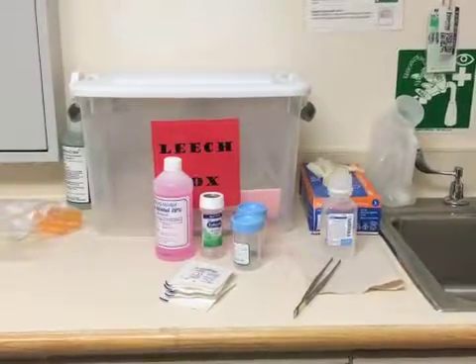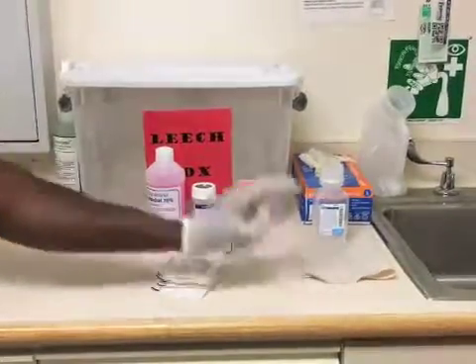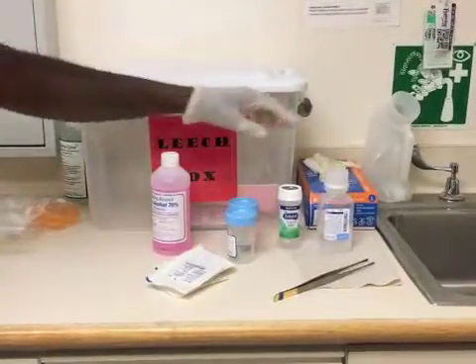The supplies needed are two specimen cups, forceps, gauze, D5, Vaseline, and sterile water.